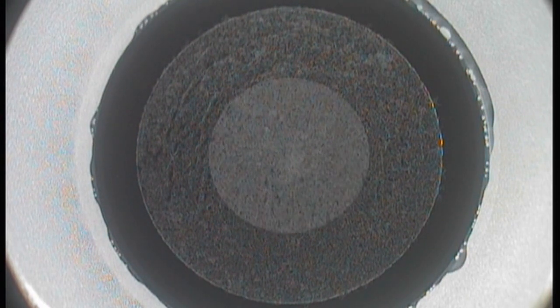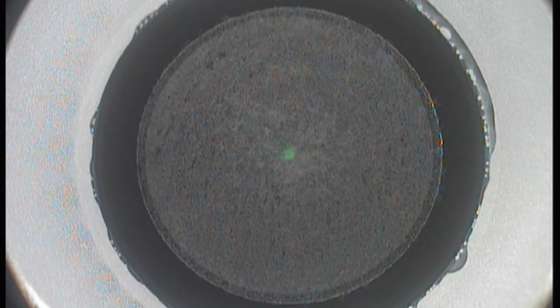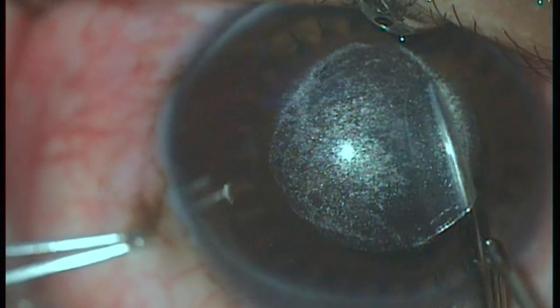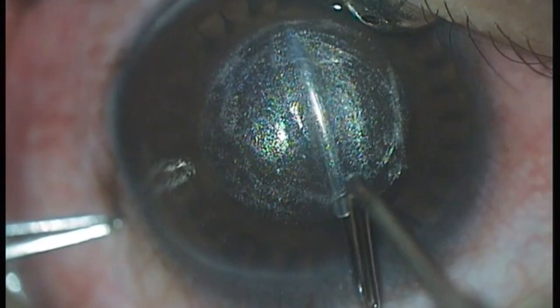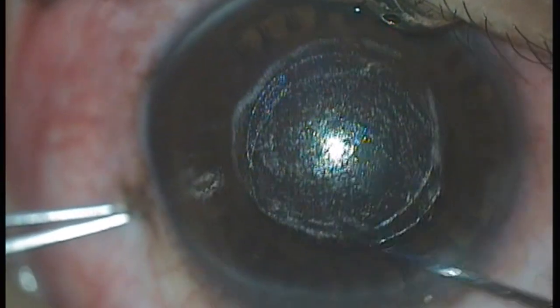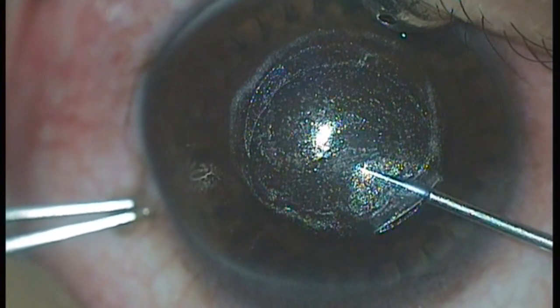First, the VisuMax system performed a lenticule cut, followed by a side cut. Finally, the cap cut was performed and the entry tunnel was created. The superficial and deep parts were delineated, and in two sweeps the lenticule was separated. It was then extracted with the micro forceps.